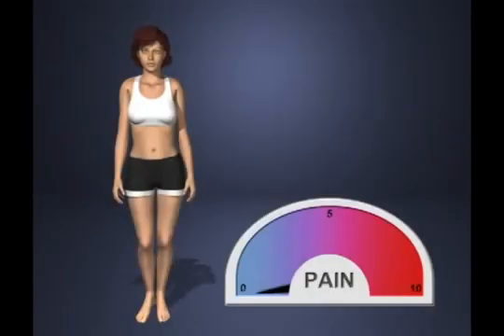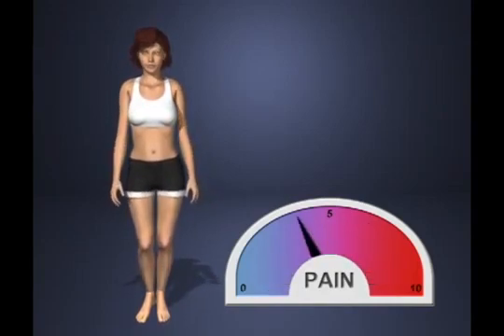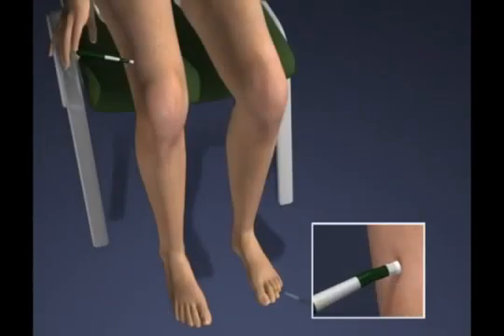Evaluate your pain before, from time to time during, and after each treatment. This may consist of simply moving into a position that causes you to be more aware of your pain, then noting the level of pain you are experiencing from 0, meaning no pain, to 10 for maximum pain at the beginning and end of each treatment. Apply the probes to clean, dry skin.